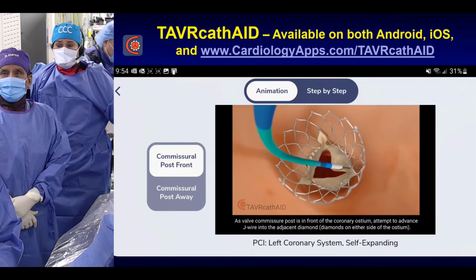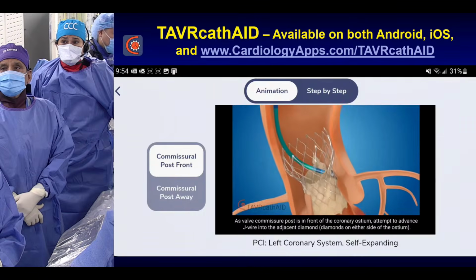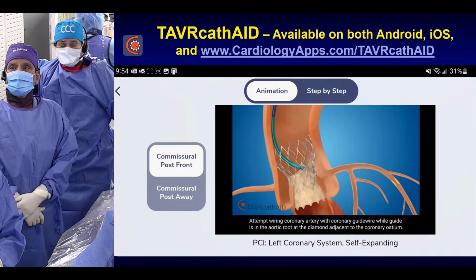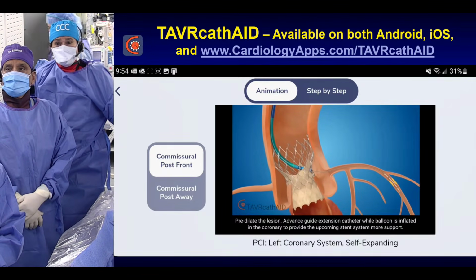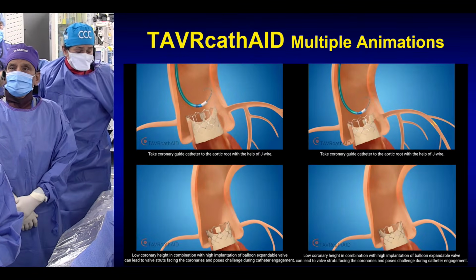So this is the 3D animation, bird's eye view, exactly what I did. So once you are there, no, this is wrong. Engagement has to be shown. You're already showing intervention. Go back to the engagement. Do you have another engagement?